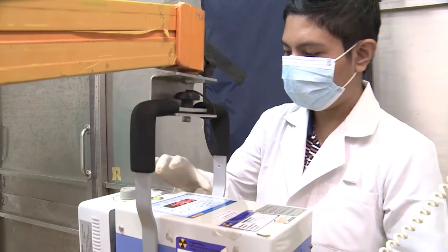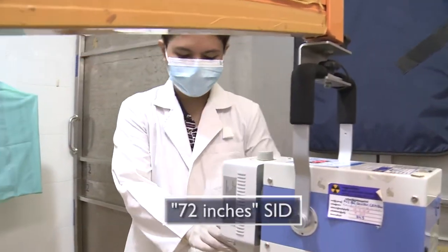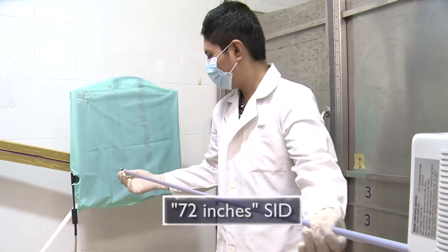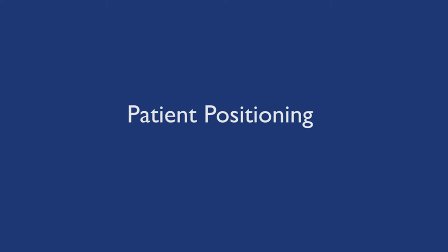In the room where the mobile radiography will occur, place the tube at the recommended source-to-image distance of 72 inches. Alternatively, keep the distance between the tube and the detector at arm's length. Adjust the tube and detector until they are centered.